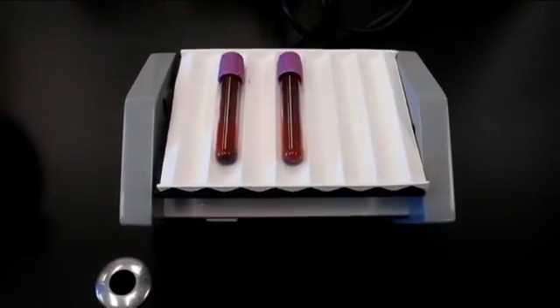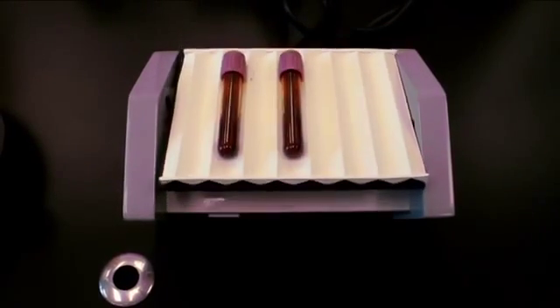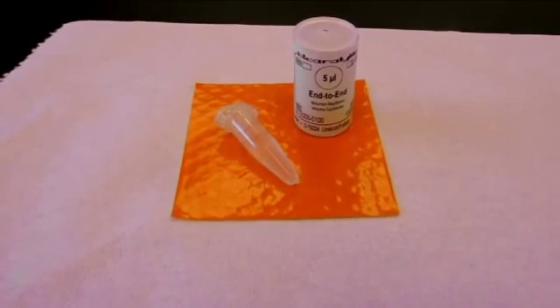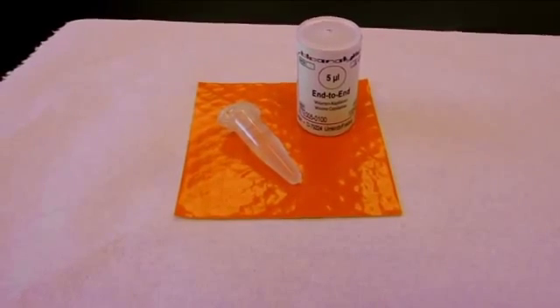As always, begin with a well-mixed sample of whole blood. For this procedure, you will need to make a 1-200 dilution using the ErieTik kit.